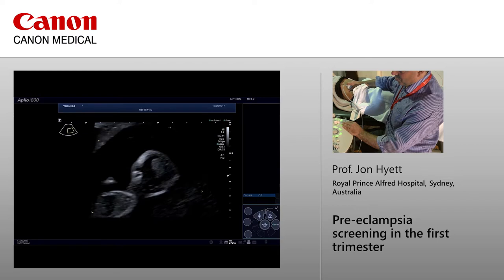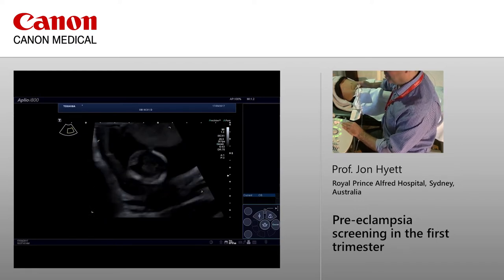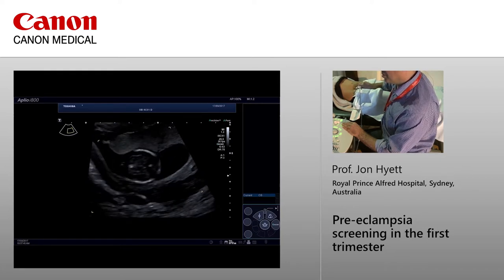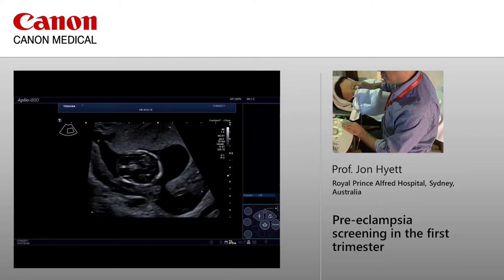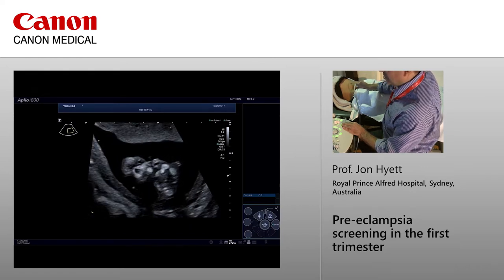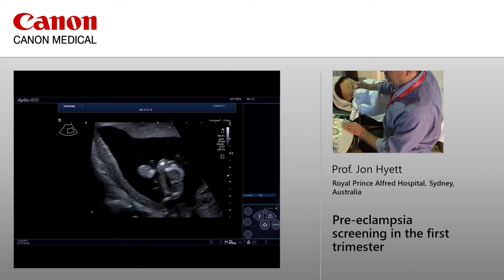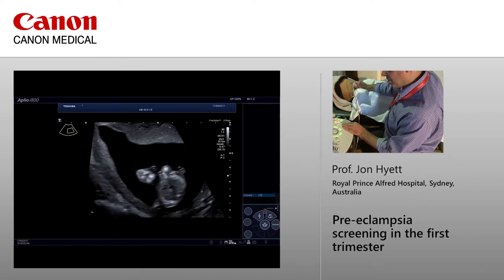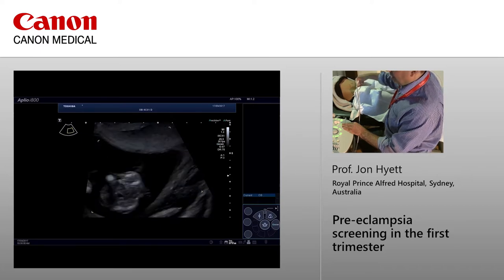I'm at a slightly awkward angle to see the nuchal translucency properly. If I come into a slightly different plane, you can see the BPD there, you can see the choroids. You can see the falx quite nicely. Just as I come down here, you can see the face quite nicely. You can see the mouth, and you can make out in this plane, although it wouldn't be the plane you would use for screening, the two nasal bones. You can also see the lip there.